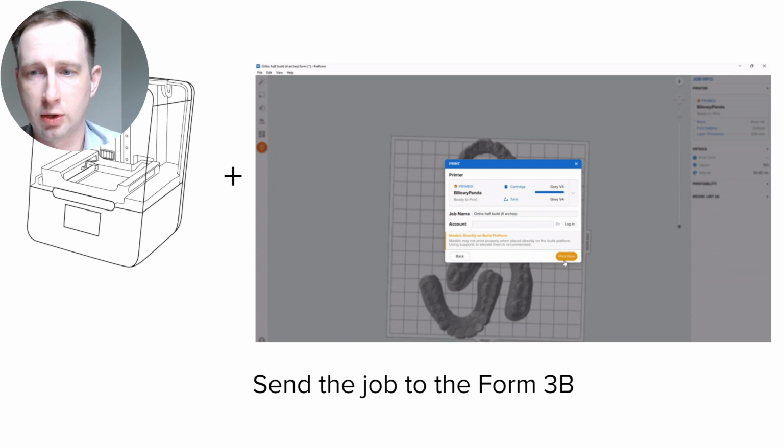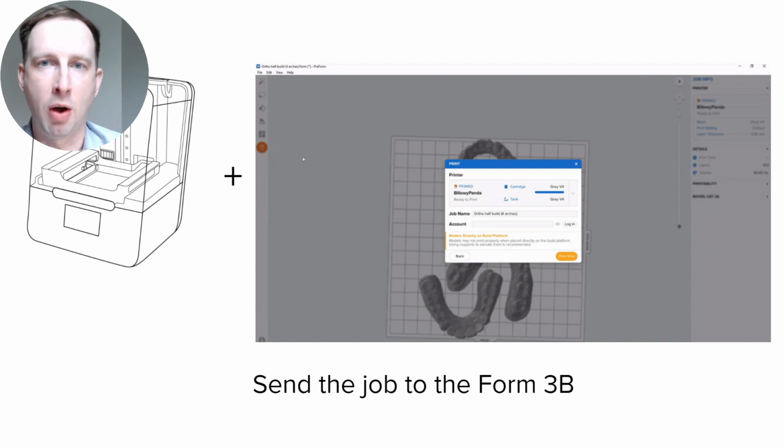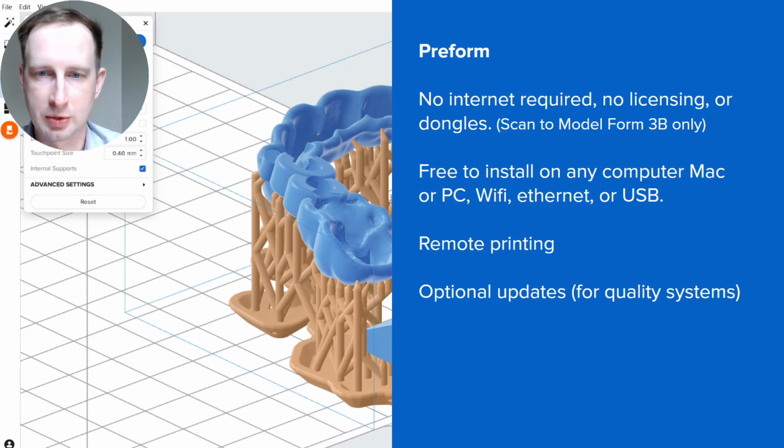You select your printer, it sends the job over, and the printer's connected either through Ethernet, wireless network, or even USB if you want to be off the internet with the system for some reason. PreForm requires no internet, so like I mentioned, using USB to connect to the printer. No internet required, no licensing, no dongles, so you're never blacked out if a dongle service is down.